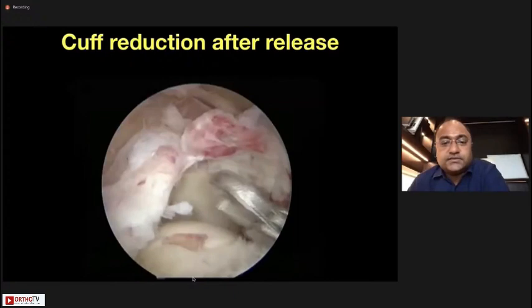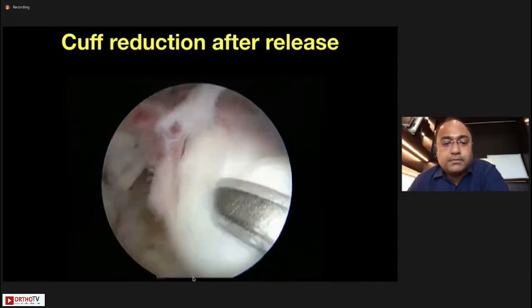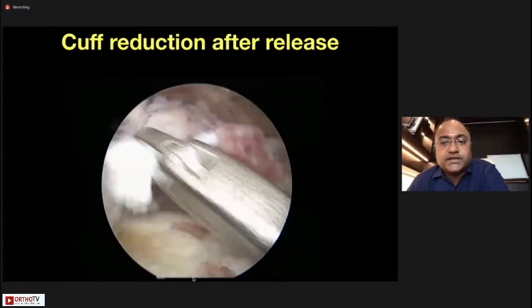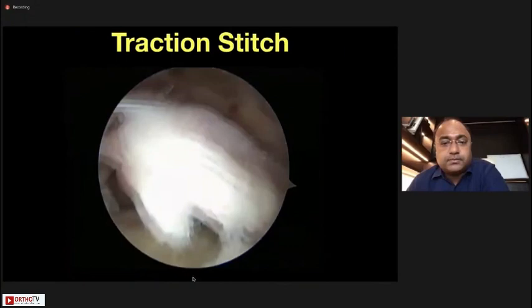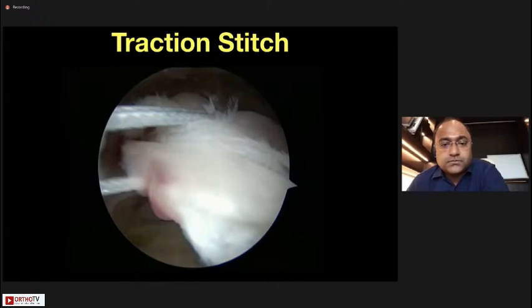Now let us see if the cuff comes back. With these releases, you can see how flexible the cuff has become — I am able to get it all the way to the edge of the tuberosity. Most shoulder surgeons would agree that many tears which appear irreparable then become reparable. Following fracture principles, you take a traction stitch, find out the direction — this is an L-shaped tear.